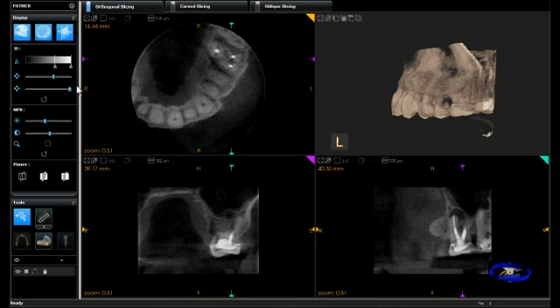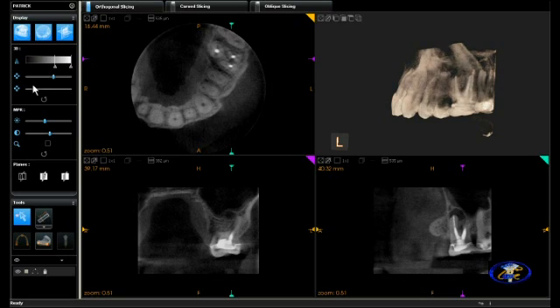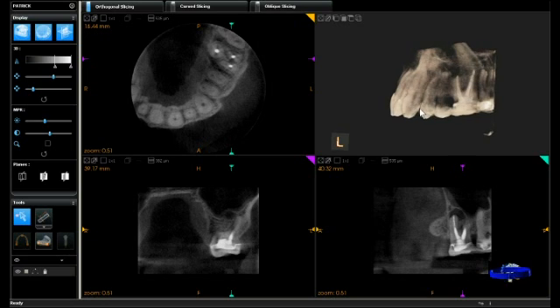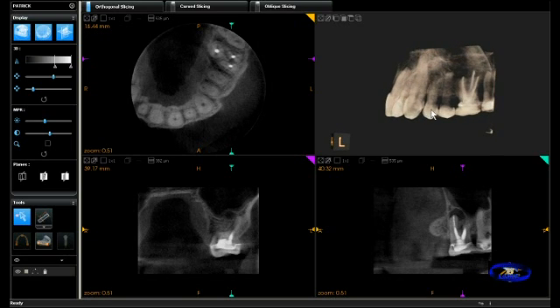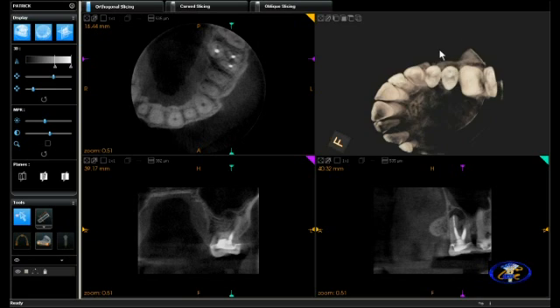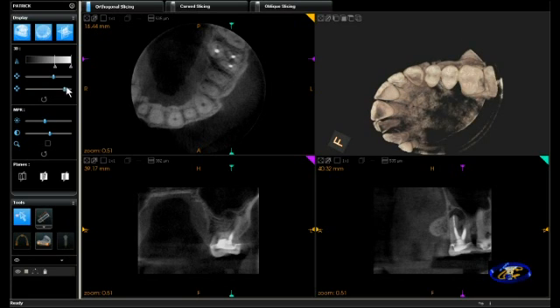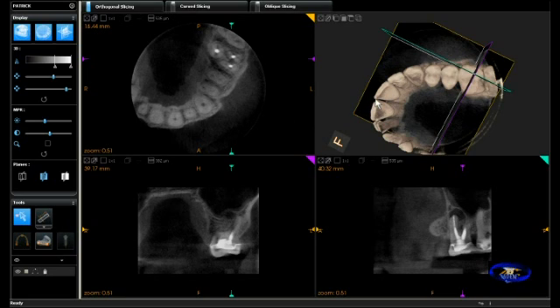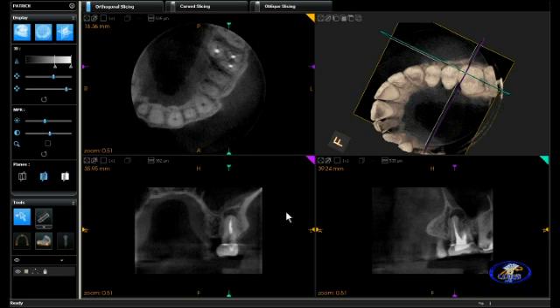This image was acquired with the Kodak 9000 3D focused field CT system. It's a volumetric image which allows us to see the region of interest clearly. In the upper right we can see the volumetric representation of the area and the root canal morphology. If we rotate that volume we can view the occlusal surface of the teeth, add a bit more opacity, and then add the cut planes corresponding to the axial, coronal, and sagittal views.